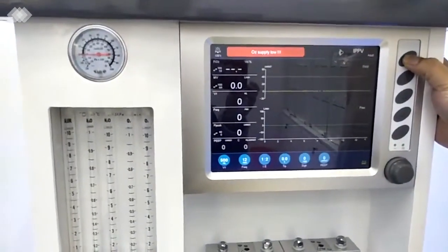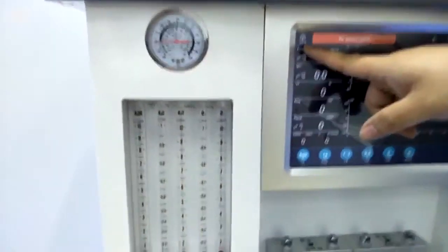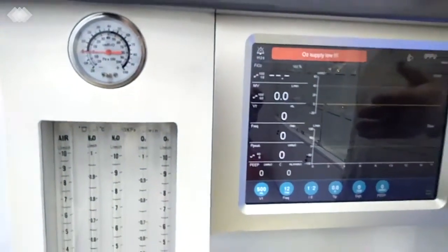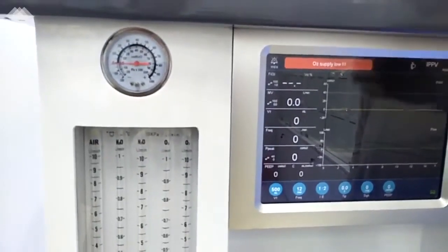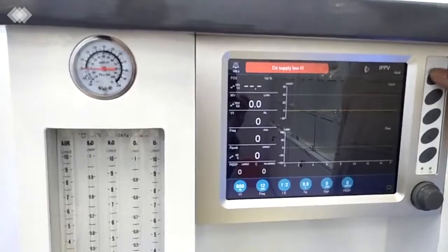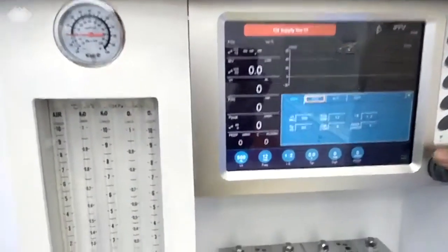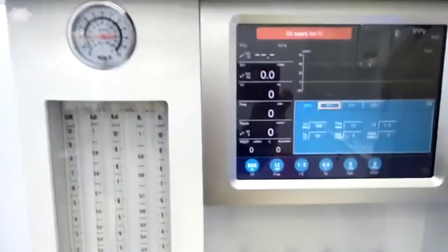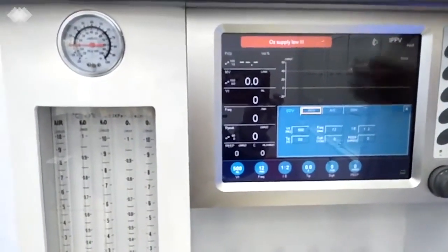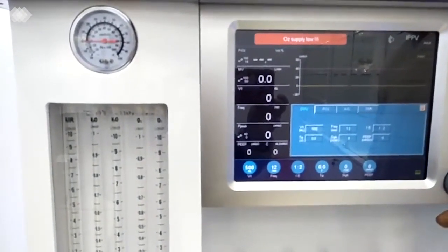The first button here is the mute button. Once we press it, there is a time counting for 2 minutes. After 2 minutes, the alarm will recover again, because we should ensure that the doctors will never forget about the alarm. And if you want to recover it suddenly, just press it again. The second button here is for changing the ventilation mode. It's usually used after one patient has used it, or if the patient is in some emergency situation and we need to change the ventilation mode or the parameters, then we will need to press this button.